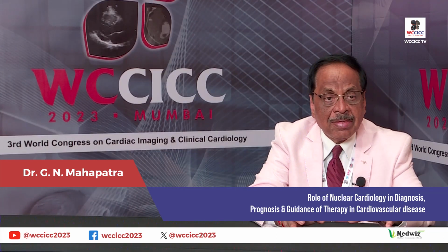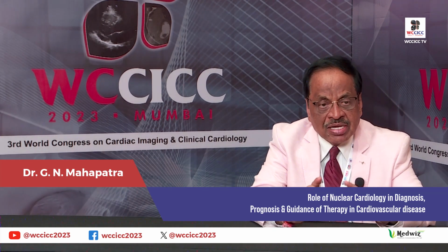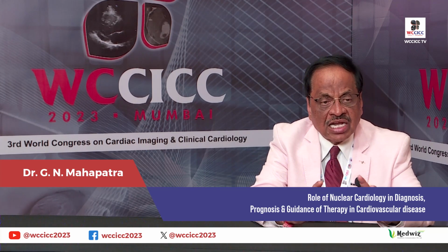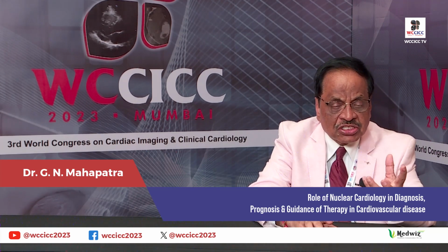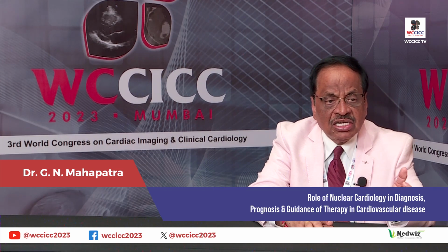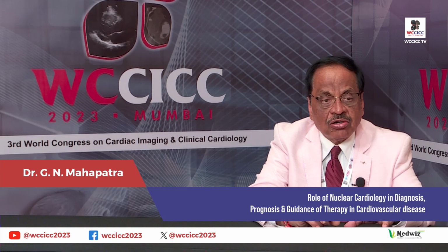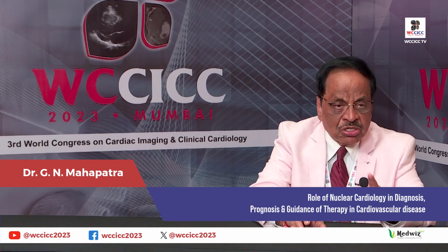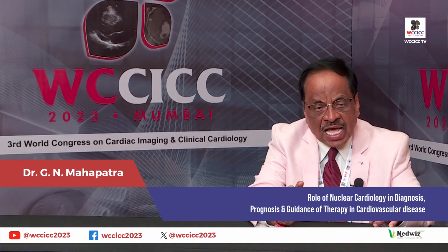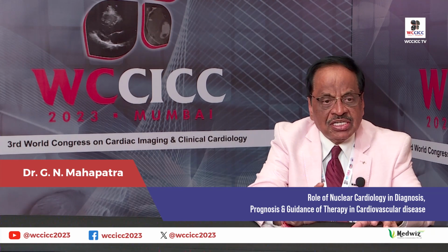The third area is patients having an old infarct who have been referred to us, and the ejection fraction, the pumping, is very low, 30-35%. In that case we have to find out whether the muscle is viable or non-viable. So we do a resting perfusion scan on one day, and the next day we do an F18 FDG viability scan.